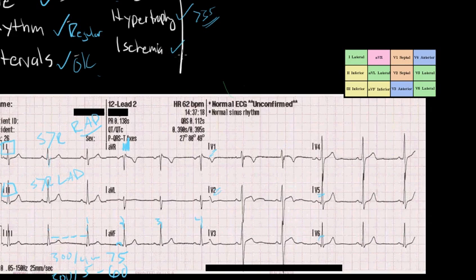And finally, you want to look for signs of ischemia. Ischemia, again, you want to look at your ST segments. If your ST segments are strongly elevated or depressed, that can be a sign of ischemia. So if this was very elevated like this, I'd be a little bit worried. Conversely, if you see T wave inversions, like you're seeing here, if you see T wave inversions, that can be a sign of ischemia. Now, it's worth pointing out that there is a backwards Z here.